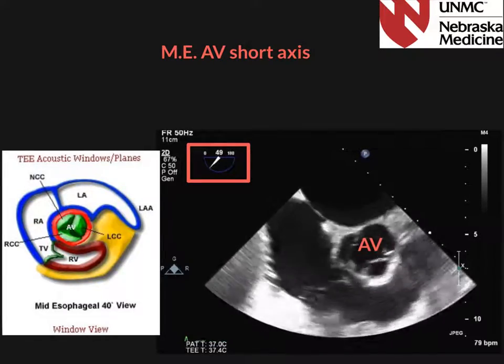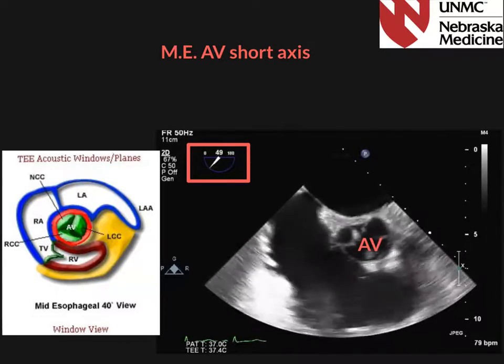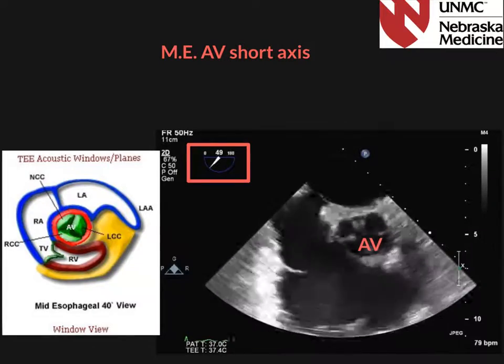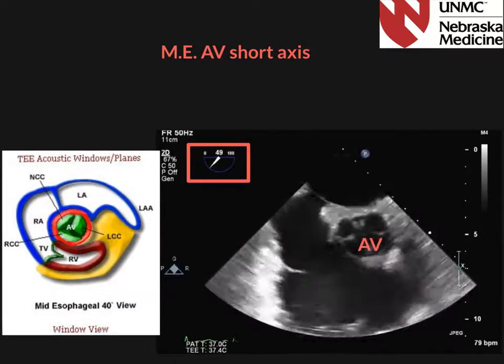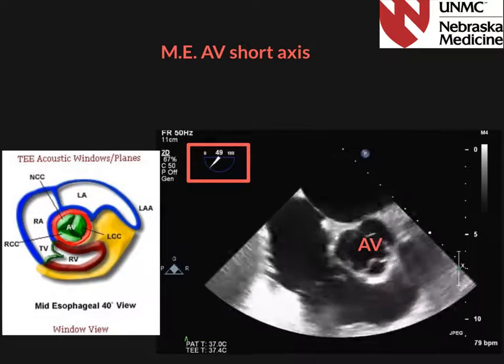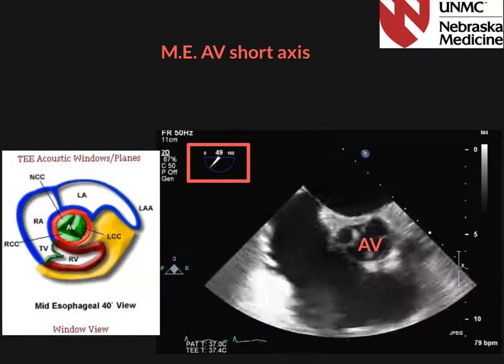trileaflet, as would be expected in most normal human beings. The three coronary cusps of the aortic valve are the left, and the right, and the intraatrial septum typically will bisect the non-coronary cusp. One should also note any obvious calcification of the aortic valve during this view.